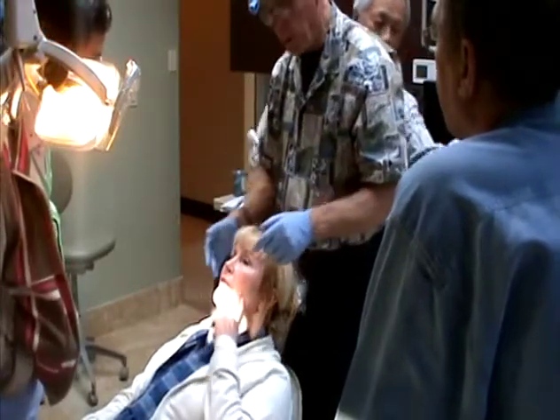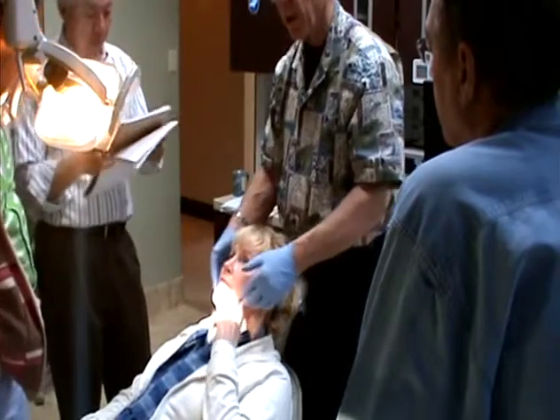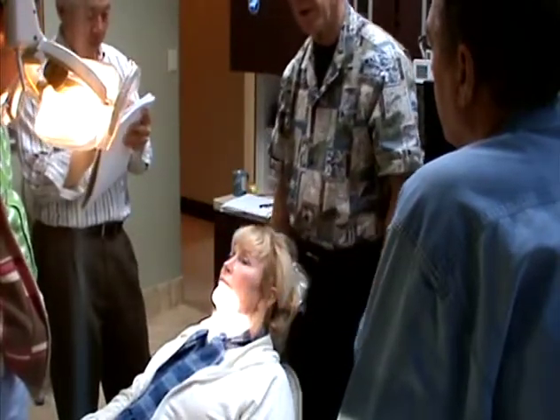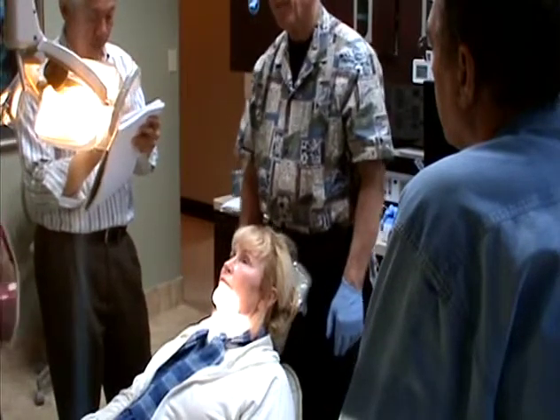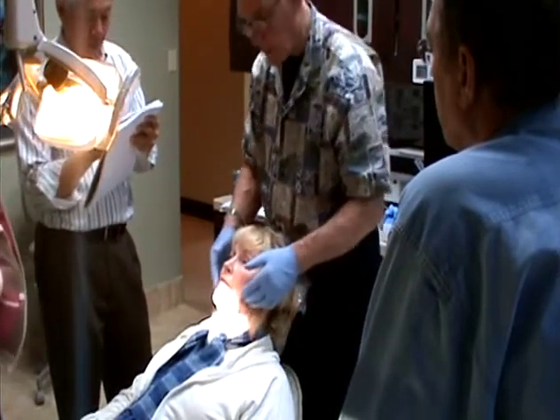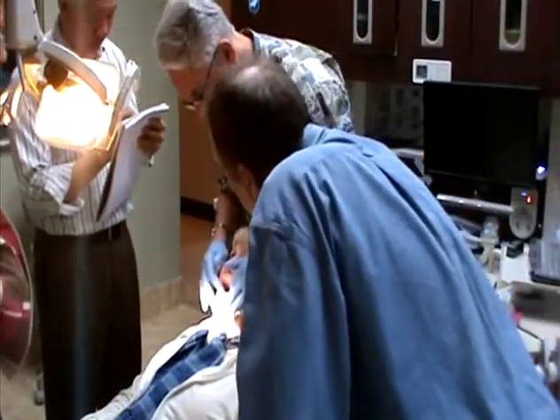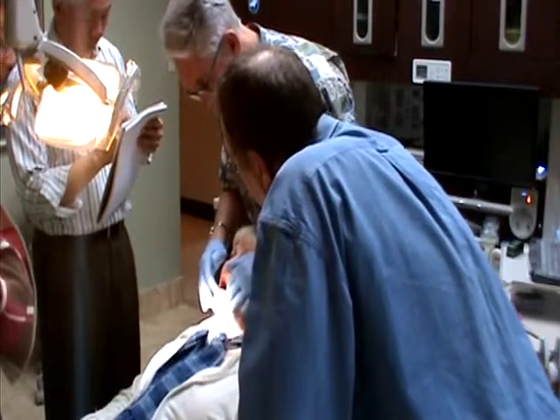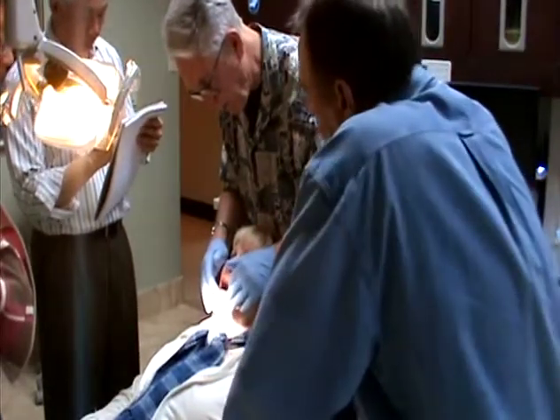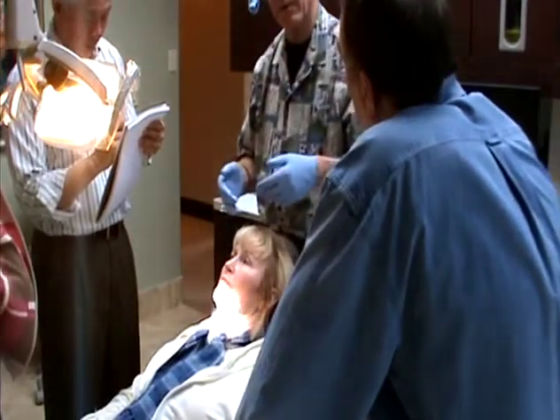And you do the same thing on this side at the same time, until you get the teeth touching. Then you leave the teeth touching in an adult for about 3 months. And then after those are touching for 3 months, you can start. You cut off the tops of these, and then you put an up bend on a wire to those, and you wear the elastics on those, and you pull those up to that level.